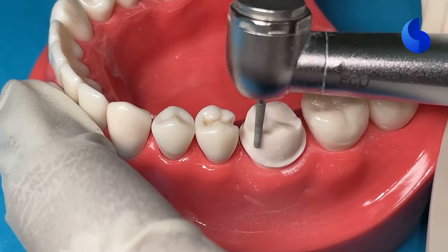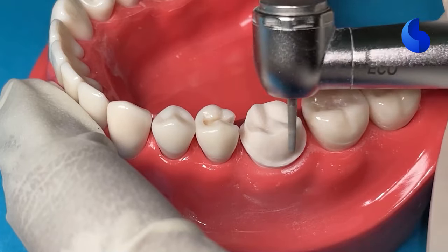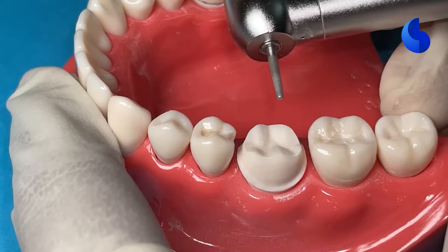You'll see this fine tooth powder that comes out when you're using this burr, which is to say that this burr really doesn't remove a lot of tooth structure. It's only removing those scratches.